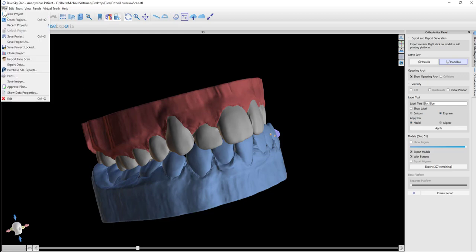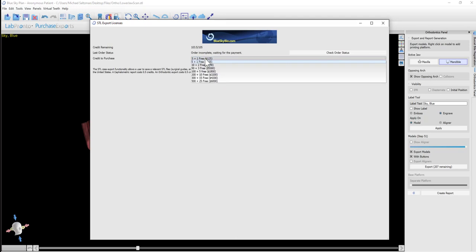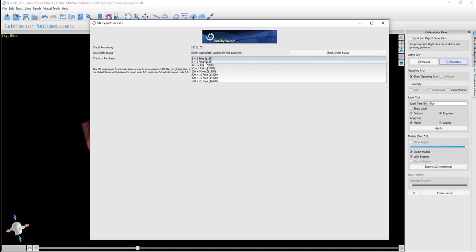By going to File > Purchase STL Exports. You have a drop-down menu for the number of exports that you want to purchase. The larger the package purchased at the time, the cheaper the per export cost is. Our smallest package is six exports, which is a total of $125, around $20 per export.